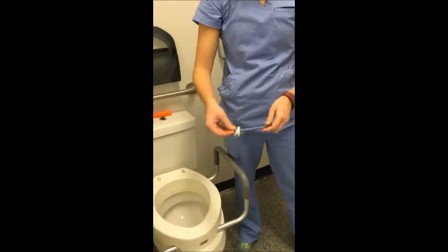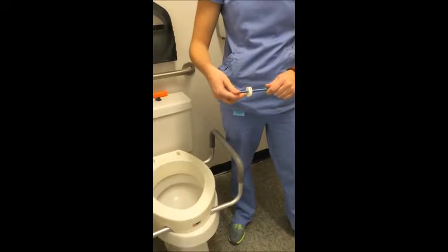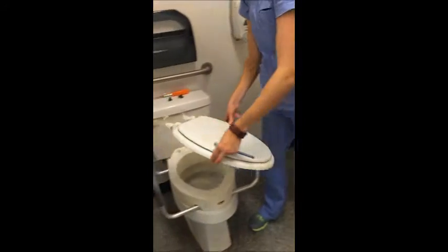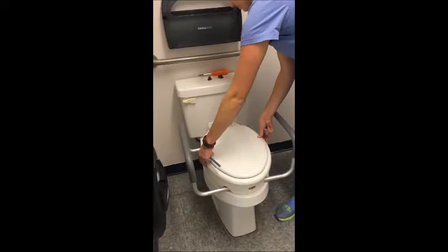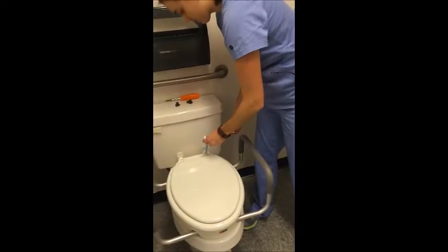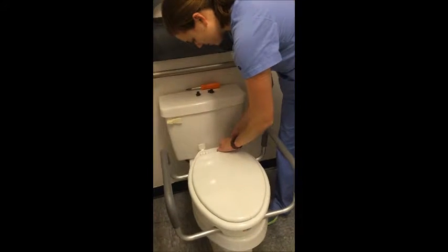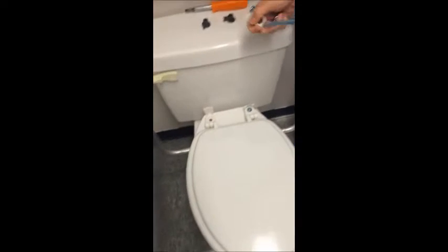You will need two long bolts and wing nuts to screw the toilet seat in place. Place the lid and toilet seat on top of the toilet, lining up the two holes in the back with the two holes on the raised toilet seat and toilet. Place the bolts through the two holes at the back of the toilet.